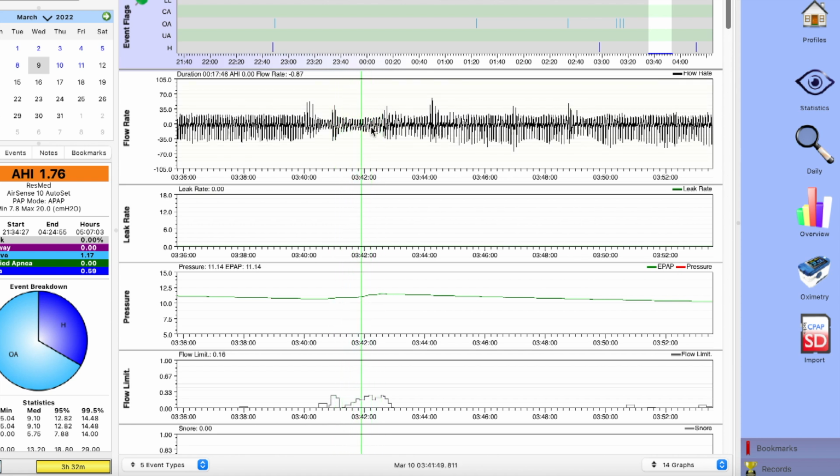But we finally get over here and we can see this very clear trough right here. And we can see, it's pinching in. This is airway collapse and it's picking this up. Airflow limitation. Pressure goes up. Why does it start going down again when we have a near identical airflow pattern right here? There's a huge collapse occurring.